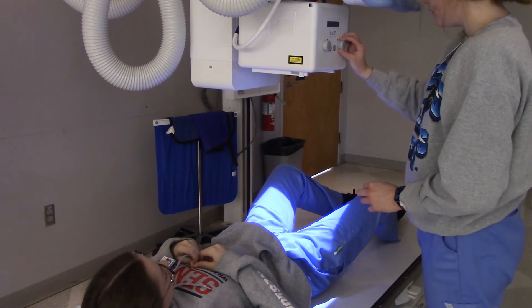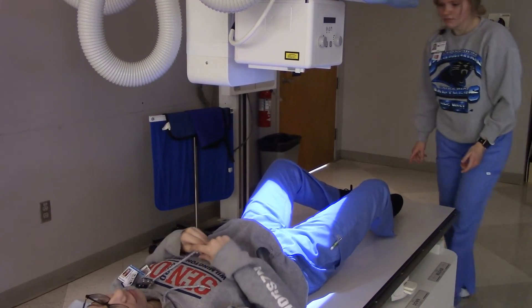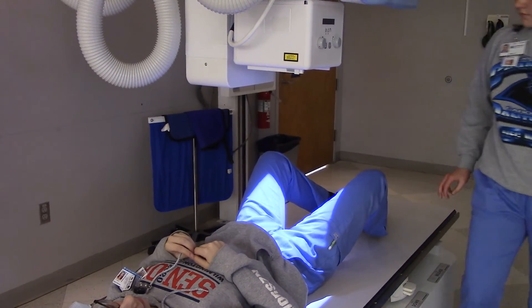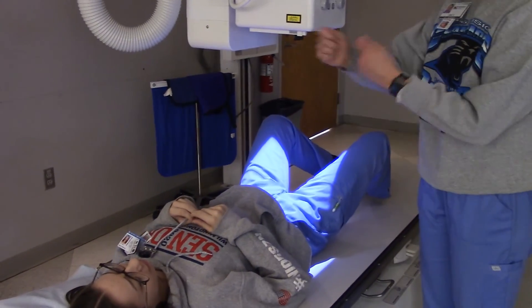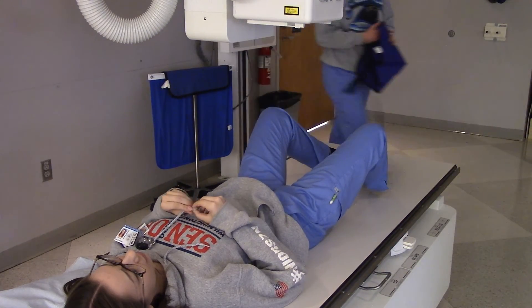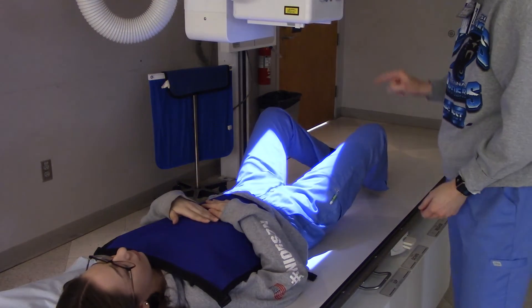We're probably going to call these. Ms. Emily, what do you think? Are you in good position? Do you want to pull your knees up just a little bit? A little bit better. Was it right? Very good. You were real close. And then I would shield her. Yes, we can shield breast, we can shield thyroid. There you go. Make sure it's not in the light.